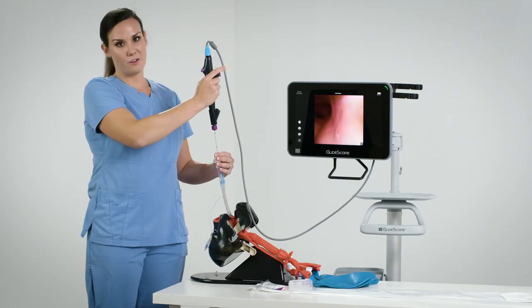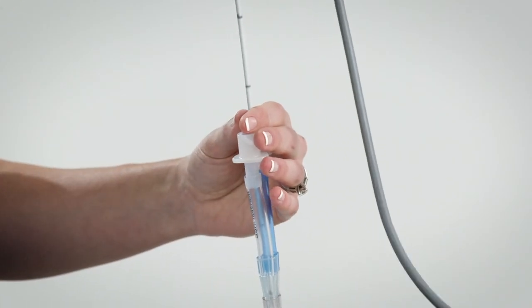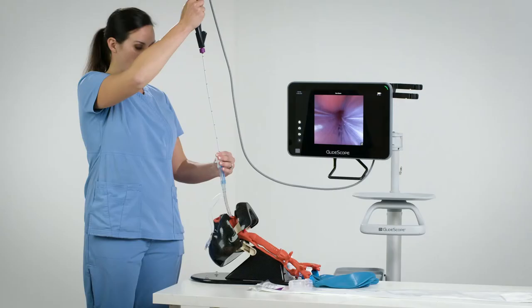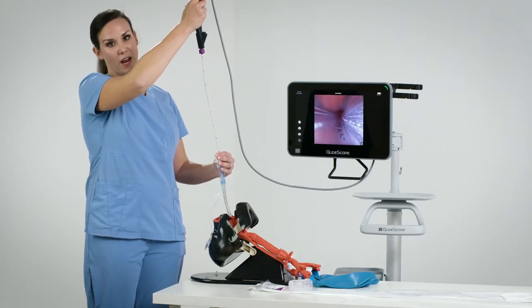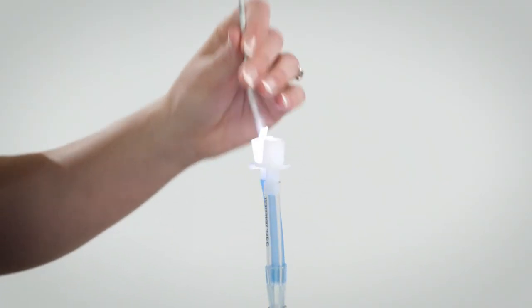Now I'm going to slowly remove my scope from the endotracheal tube, again ensuring that I've kept my scope in neutral position. If I run into any issues retracting the scope, I can inject some saline down the endotracheal tube to help it remove more easily.